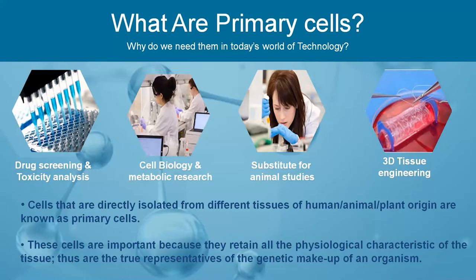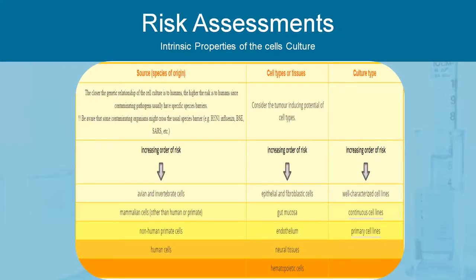With the increasing usage of primary cells, we also need to understand the biosafety concerns they may develop with respect to human health as well as risk to the environment. It is essential to assess the risk so we may implement containment measures and work practices in order to provide maximum protection to human health and the environment. There are multiple ways through which we can assess the risk.